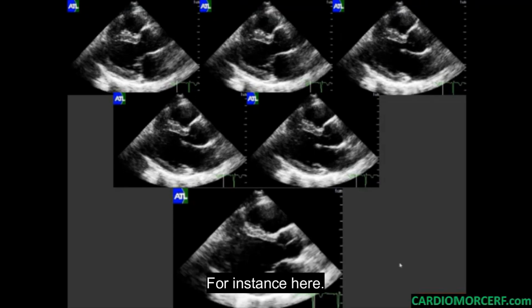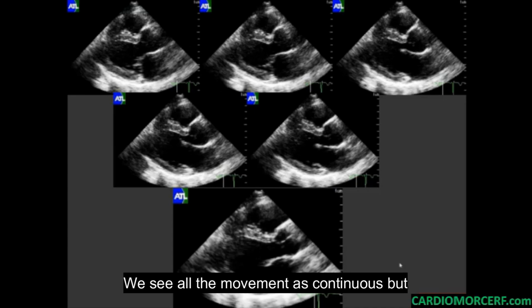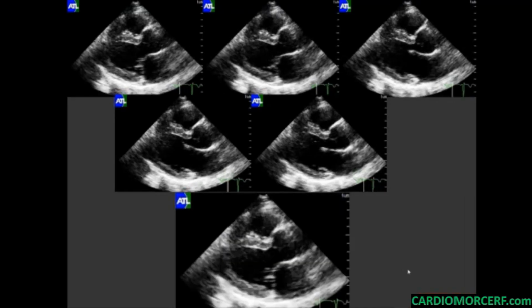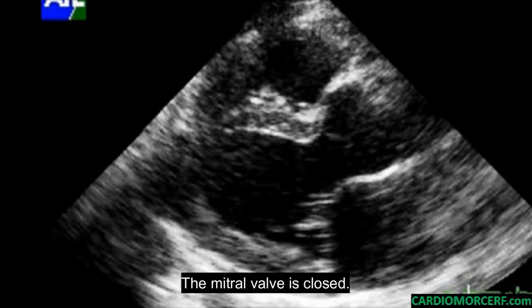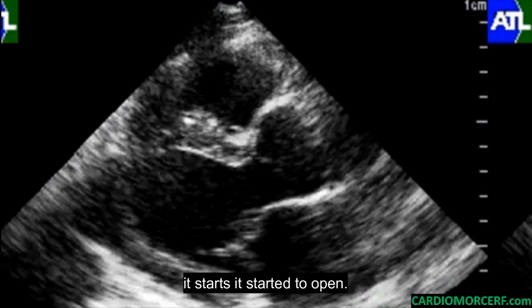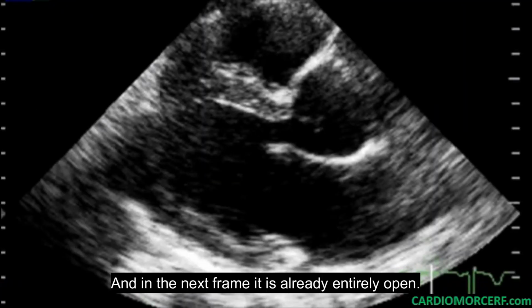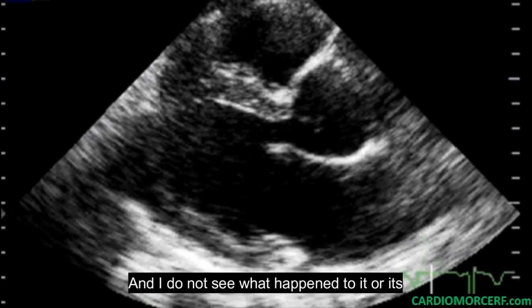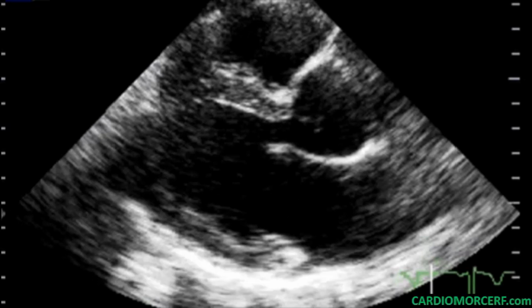For instance, here we see all the movement as continuous, but watch the reality frame by frame. Here the mitral valve is closed, and then it started to open, and in the next frame it is already entirely open, and I do not see what happened to it or its position.